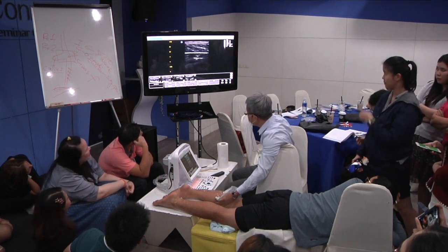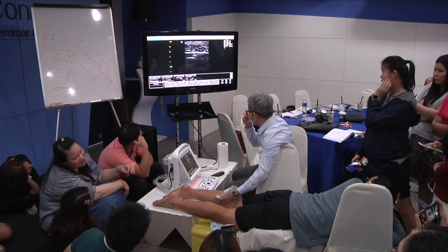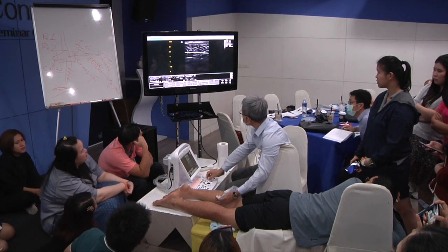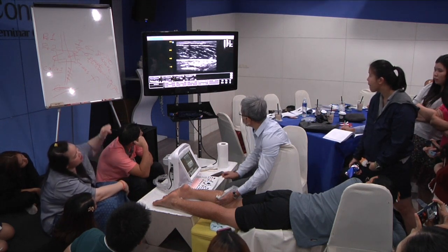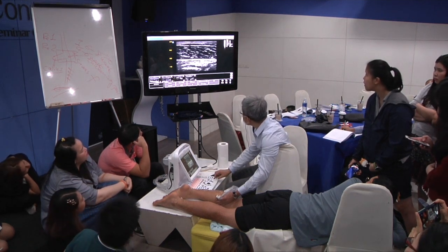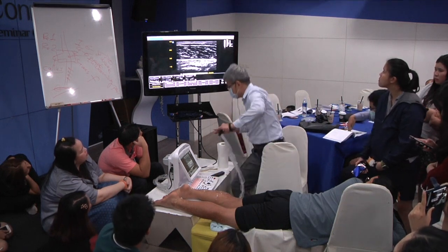If your supervisor told you you are going to do a study with ultrasound to look at the muscle morphology in medial gastrocnemius, you can run away or tell him or her you are ready.